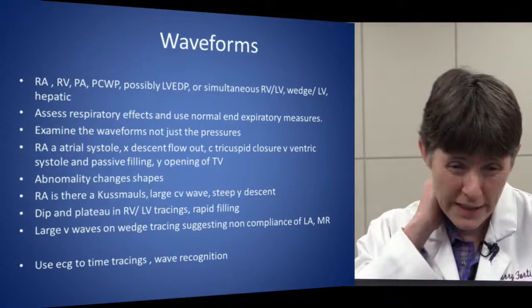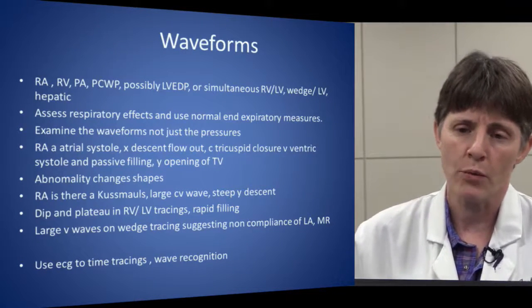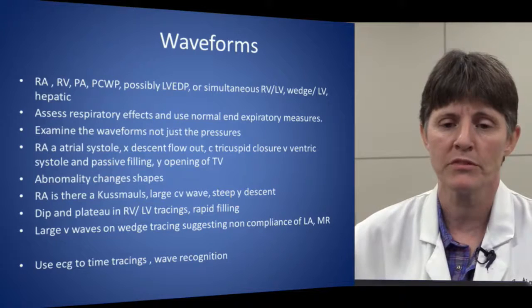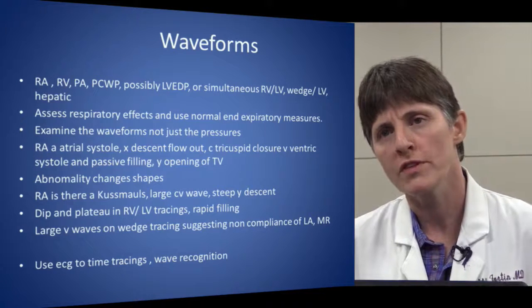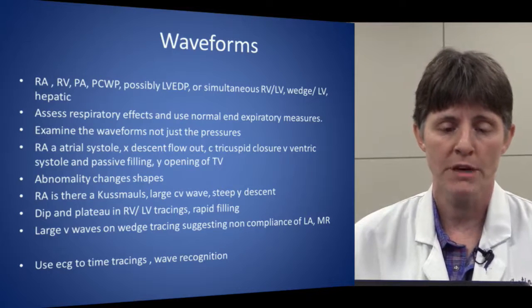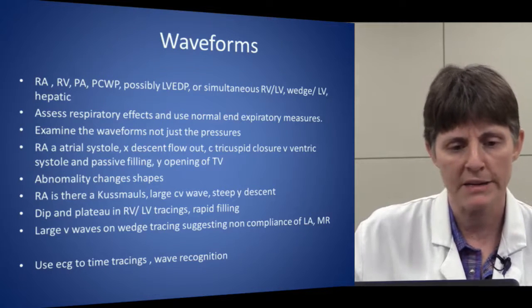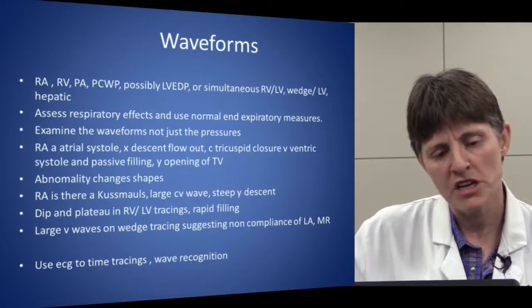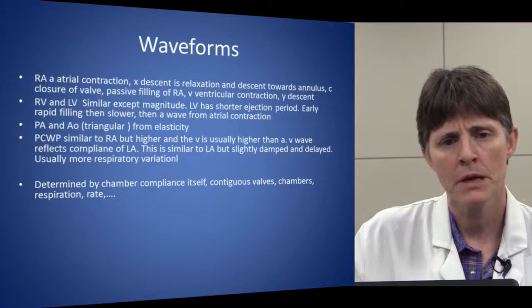The waveforms are going to look different. And again, I don't need you to remember or memorize all of this stuff, but I want you to think about, you're going to get waveforms from each of these places. You need to be able to assess or understand what happens if somebody is breathing in or out, whether there's something wrong with a certain chamber, or if pressures are high or low, above or below that chamber, because it's going to change things. Things that you see might help you make a diagnosis. One other thing, you're also going to use the EKG, and on the tracings I'll show you how to time things so you can tell which waves are which.